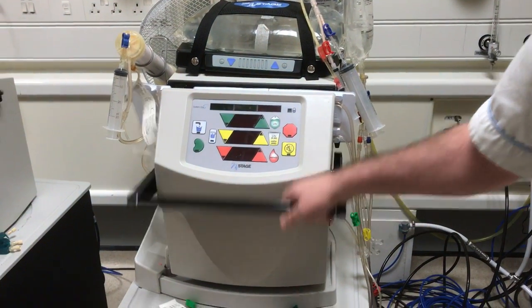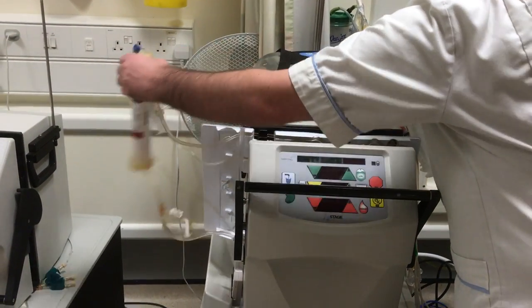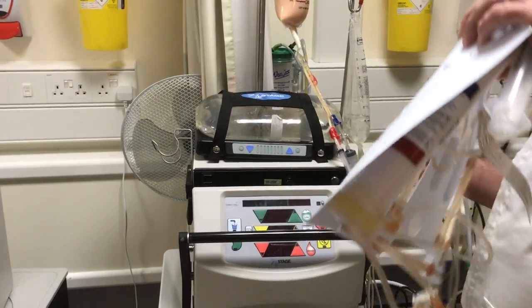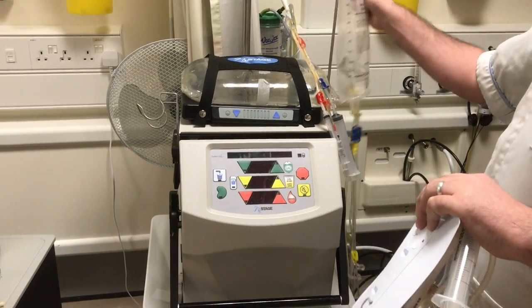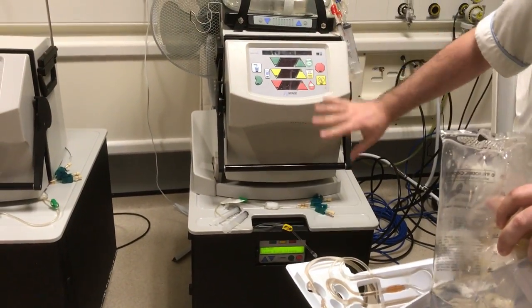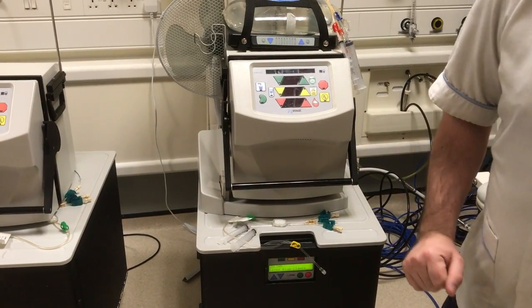Then we can open the door, lift it up, pull the door open. We can then take the dialyzer out, pull the cartridge out, then close the door. Take the saline bag — this can all be thrown away into your yellow bag. Then just wipe the machine down. If there's any blood, make sure you clean it down, and then we'll be able to make a new sack.